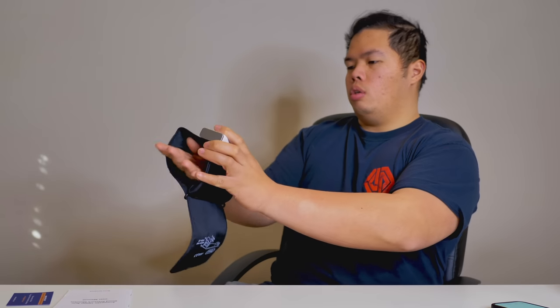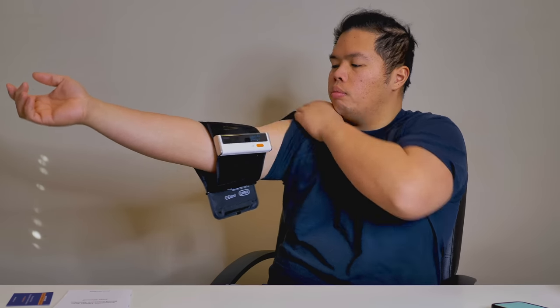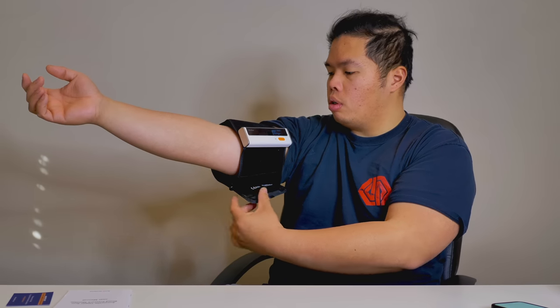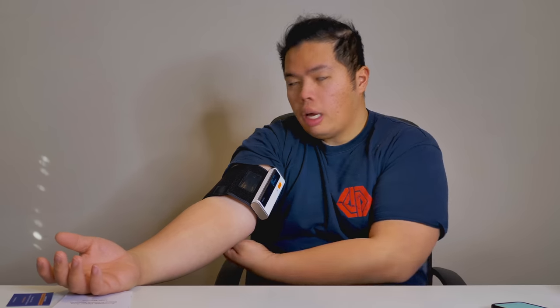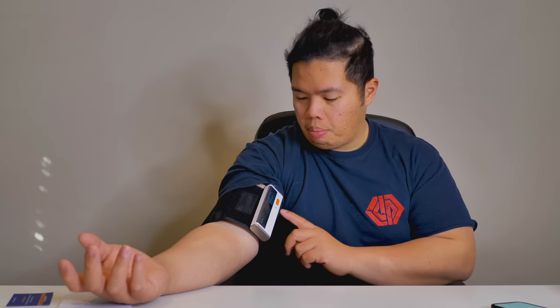Now I'll show you how it works. Basically, you just put your arm in here, about one to two centimeters from there, and then you wrap it around. It sticks with Velcro. Then you're just going to lay your hand flat and relax, and let the monitor read your blood pressure. Go ahead and hit the start and stop button.